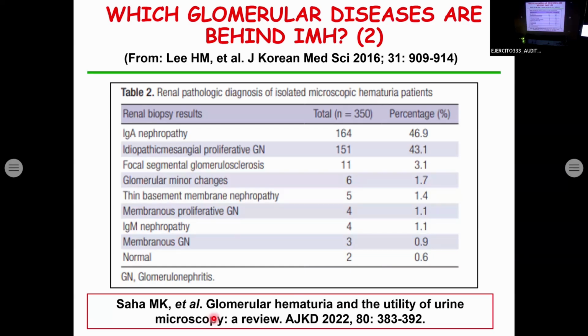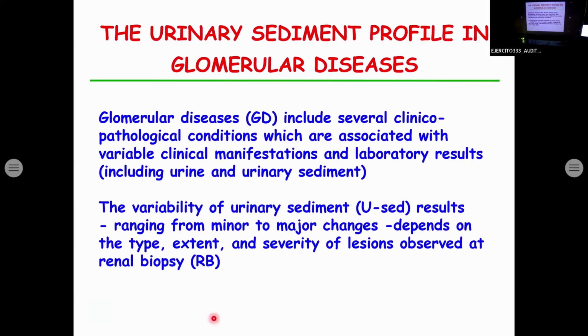So isolated microscopic hematuria is finished. And the question after? Okay. Glomerular diseases. The urinary sediment profile in glomerular diseases.